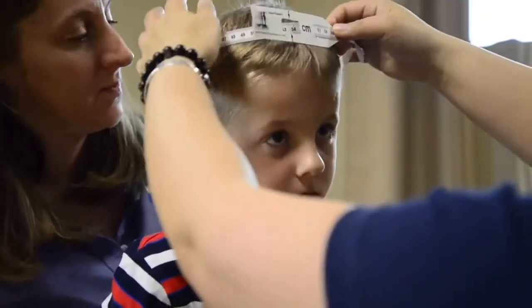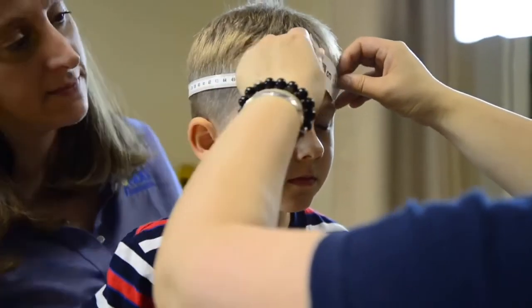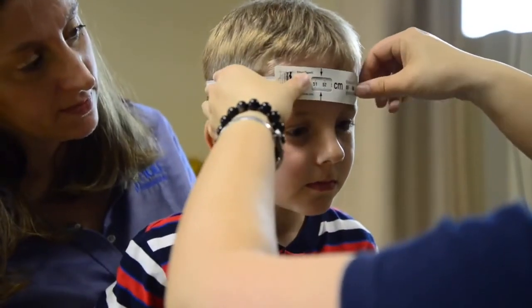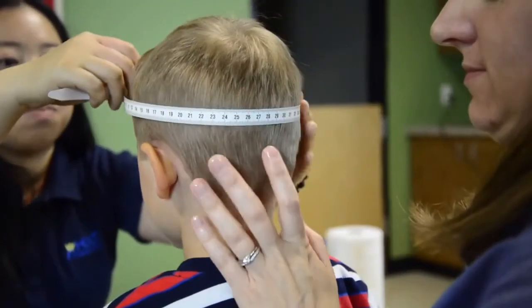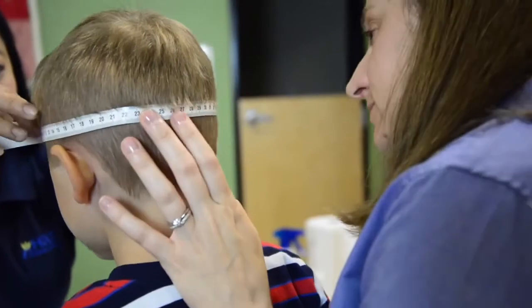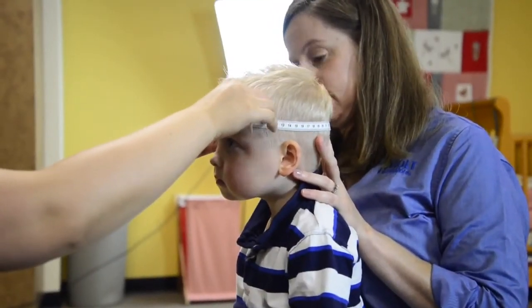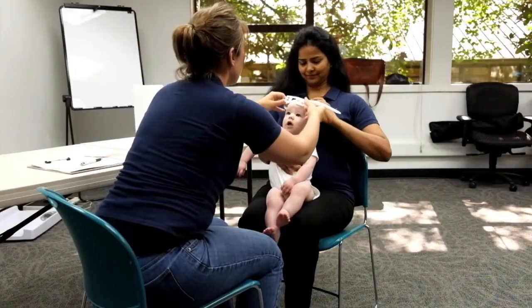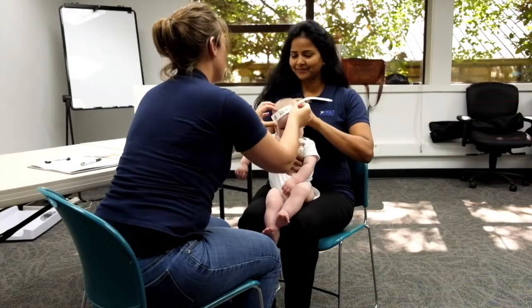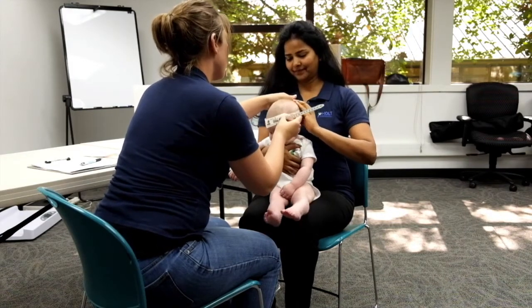Place the tape around the child's head. The head circumference tape should be placed above the ears and midway between the eyebrow and the hairline to the bump at the back of the head. However, this is a guide and not all children have the same head shape. Adjust your approach as needed, but keep in mind that your aim is always to measure the largest circumference possible.